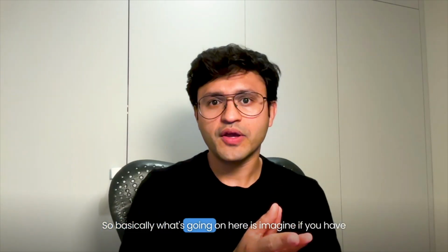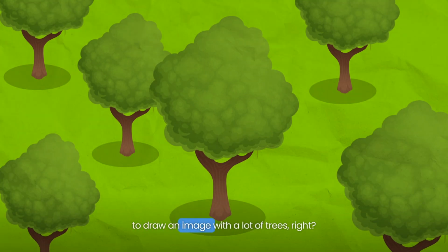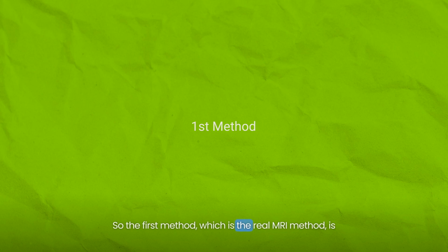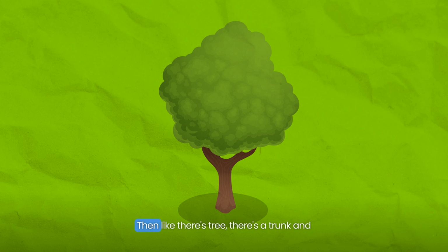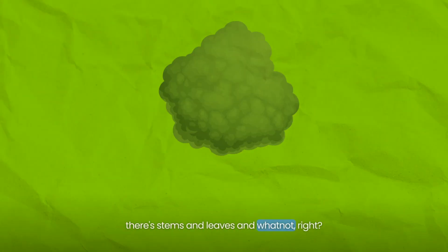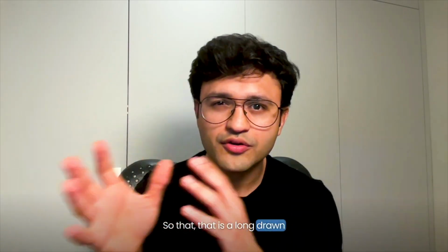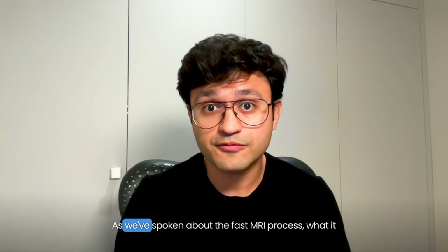So basically what's going on here is, imagine you have to draw an image with a lot of trees, right? The first method, which is the real MRI method, is like you take every tree and draw it precisely. There's the trunk, and there are the stems and leaves and whatnot, right? And then you go tree by tree, right? So that is a long drawn process. It's precise and it takes hours, as we've spoken about.